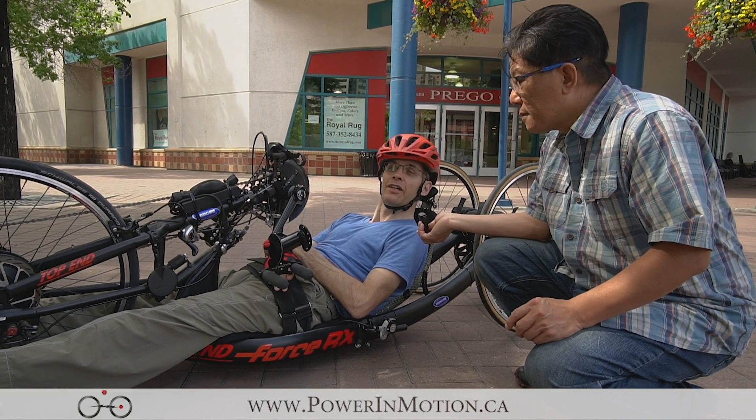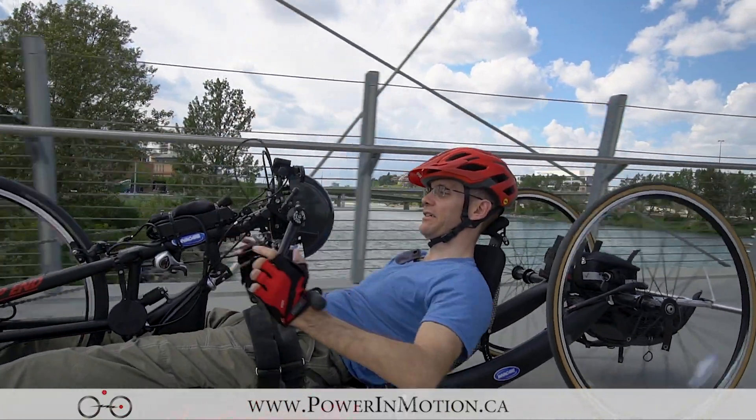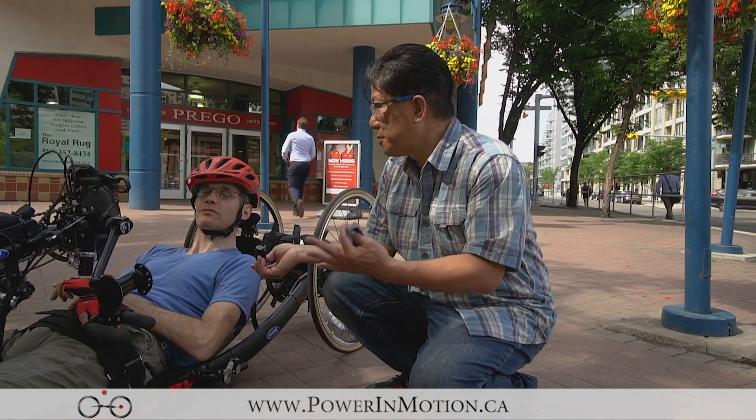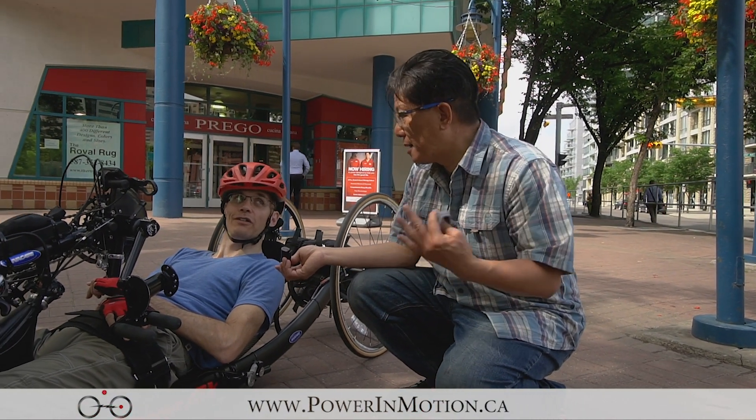That's why we came to you guys to see what sort of solutions we can come up with. You enjoy riding and cycling, but the biggest problem is when you get up certain hills, you may have a hard time to climb the hill.